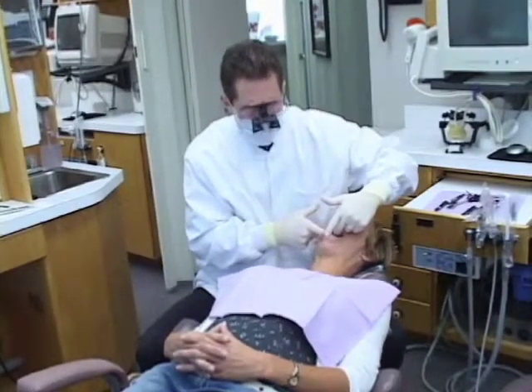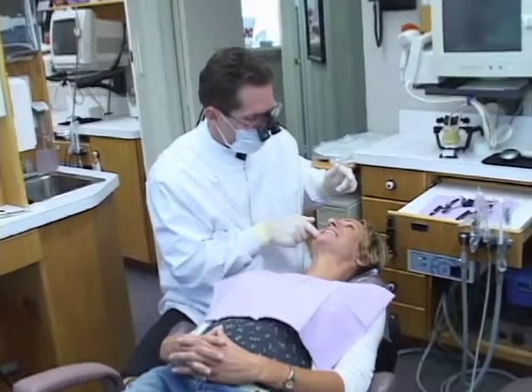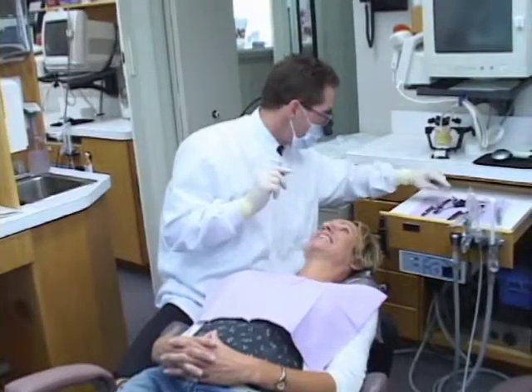I'll put it back in and we'll ask Debbie when she first becomes aware of a back tooth touching. We just keep going down the line. We're pretty close to being in contact, so this shouldn't take too long. Go ahead and tap. Feel it? We weren't far out of contact, as you can see.